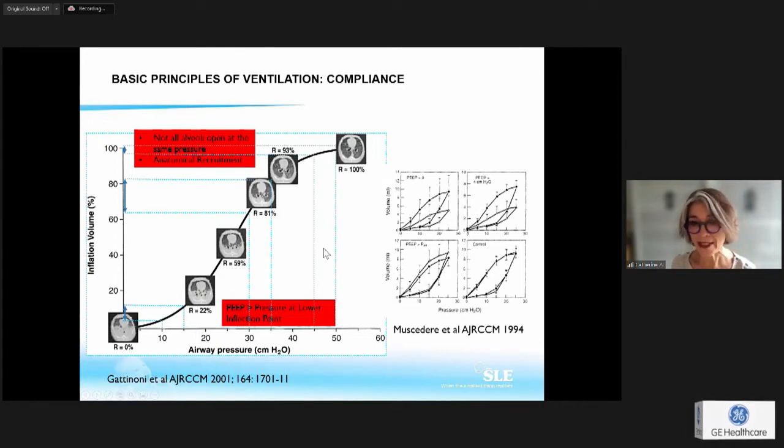And here, look what is happening. I kept going up on the pressure, and what I'm doing here, I have reached the upper limit of the expansion of my lung. The lung can't expand anymore. I have reached the over distension. So again, if I increase by 5 millibar, now the gain in tidal volume is getting smaller. Why? I went too far.